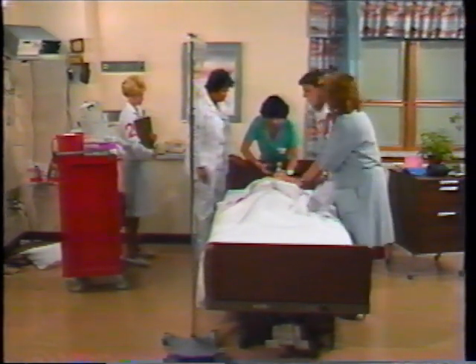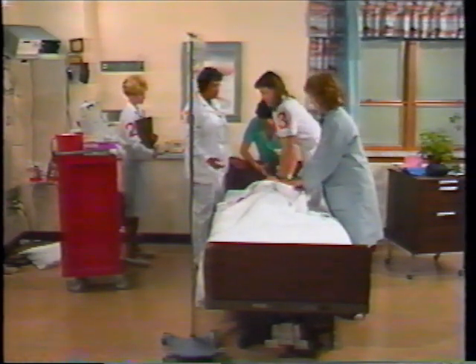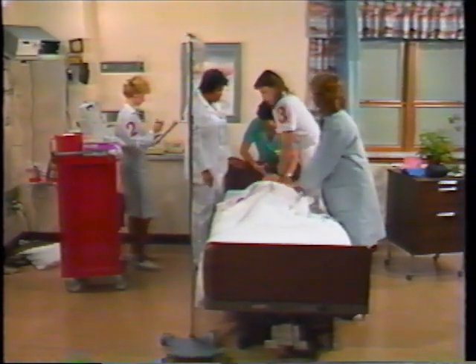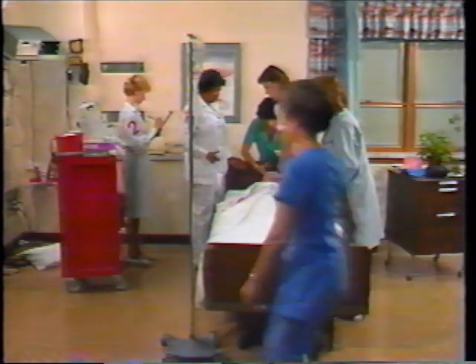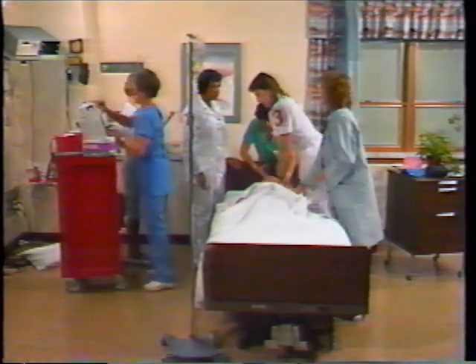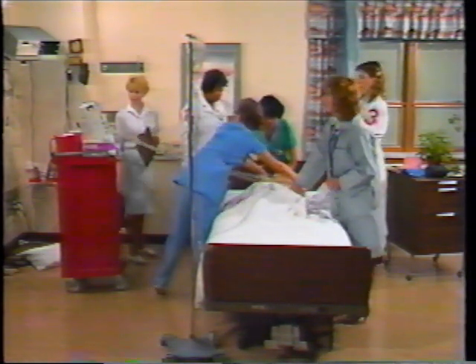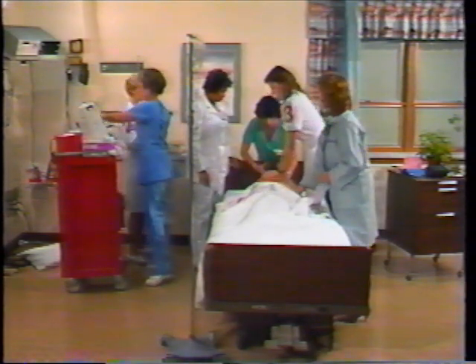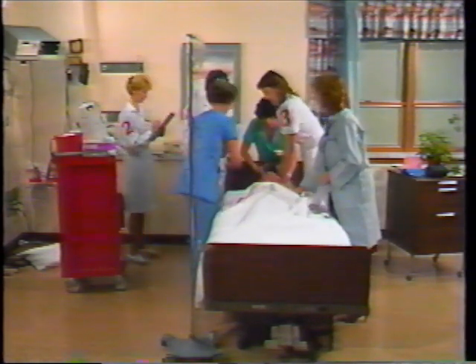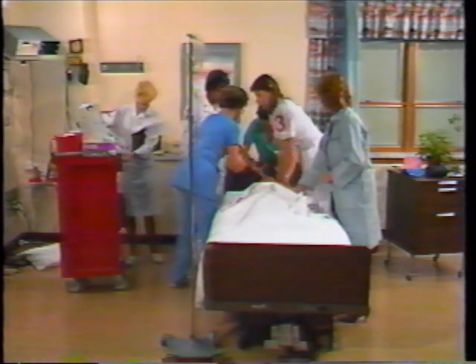Nothing. What happened? Well, this morning after breakfast, she complained of some indigestion, so I gave her some ginger ale, and she was doing fine, and I just came to give her a pain shot because she had surgery on her hip 2 days ago, and I found her non-responsive. Let's see what we have on the monitor. Asystole. Keep going. Do we have an IV? Yes, we do. Okay, let's give her 0.5 milligrams epinephrine IV push.